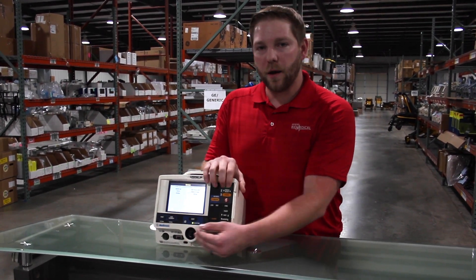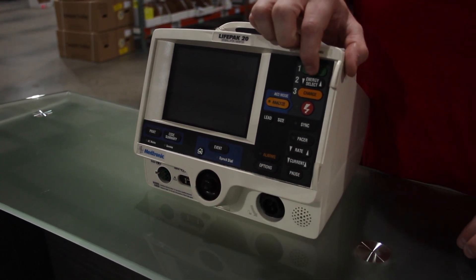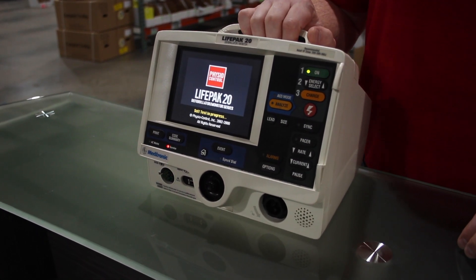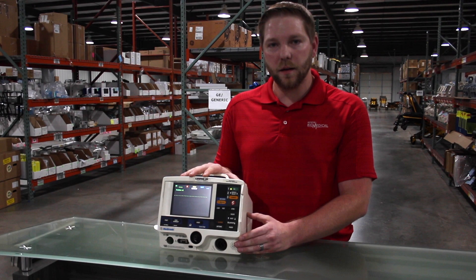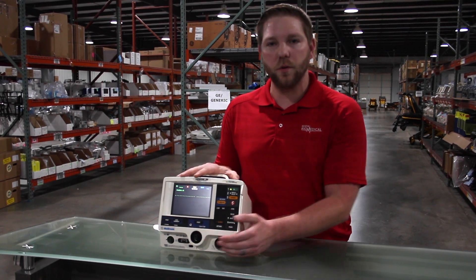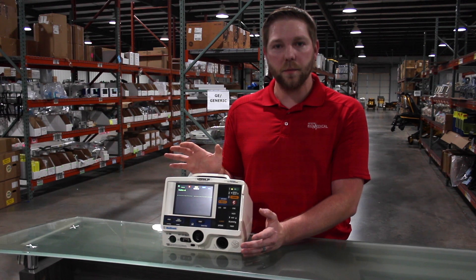Once that's completed, you can power cycle your unit, turn it off, and back on into normal operation mode. Once you're in this mode, you can go through and test all your functions such as defib, PACER, and SPO2 if your unit has it. Once you do your electrical safety test, your PM is complete.